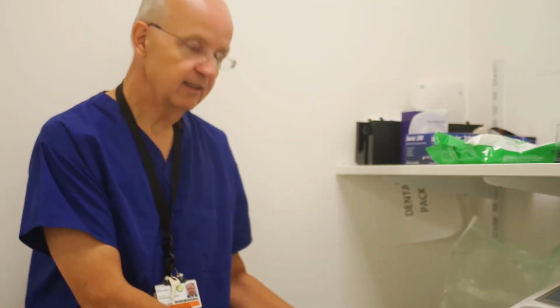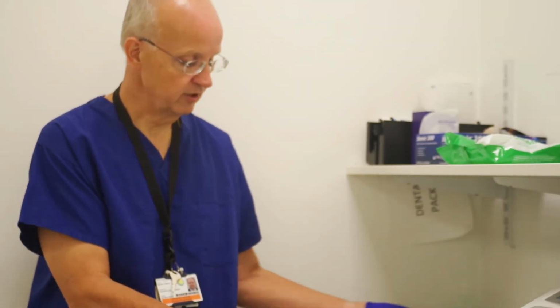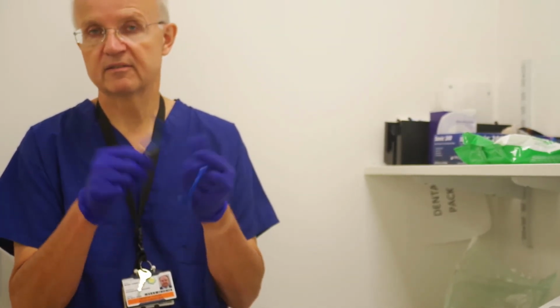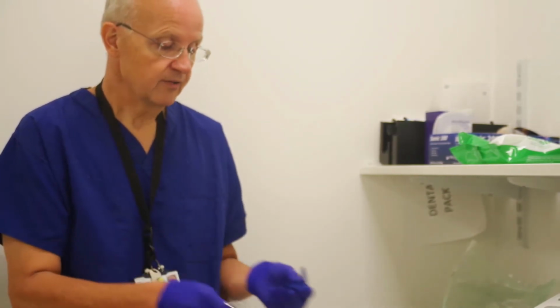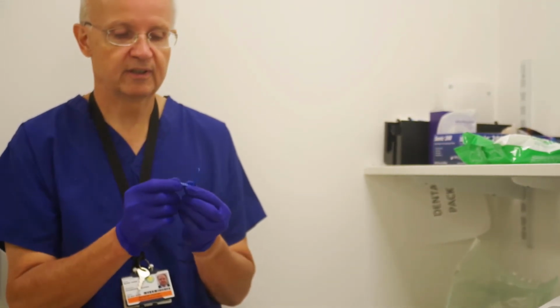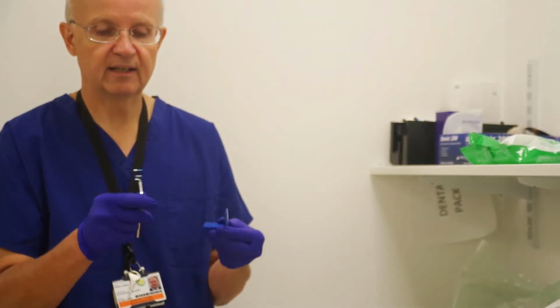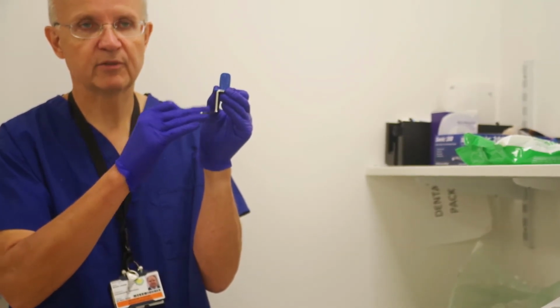Okay, so exactly the same procedure. When you open the packet, as Carlin showed you earlier, make sure that you separate all of these pieces. They will sometimes come put together, but you can't assume that people in CSSD have done it correctly. So, first thing again, think to yourself, am I doing an upper or lower? Take out the holder and look at it, face it upwards or downwards. It doesn't matter with this one, but the key thing is that when you place the bar in, it should be coming down and away from the holder like that.